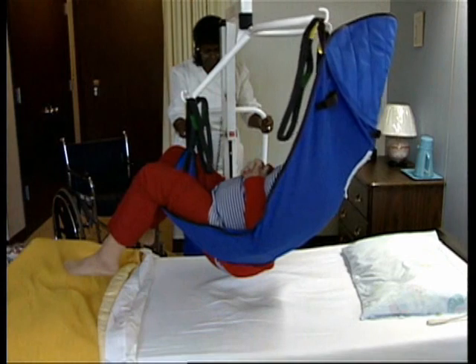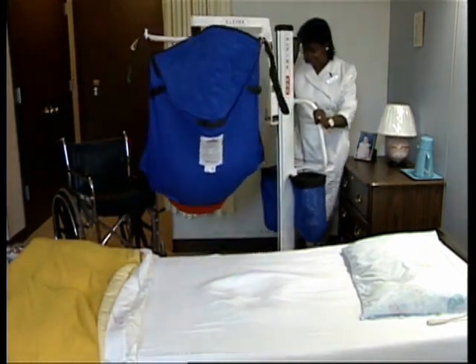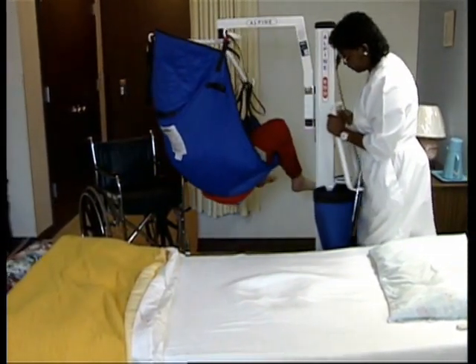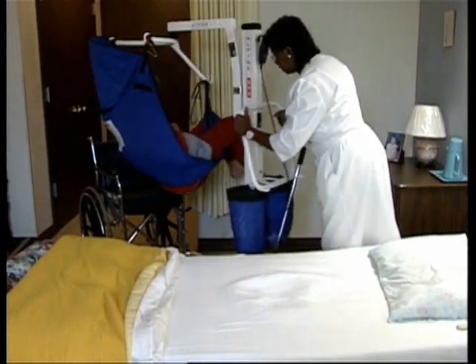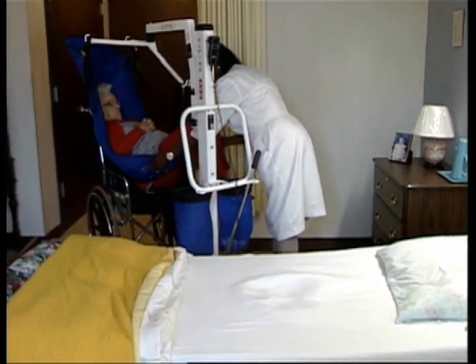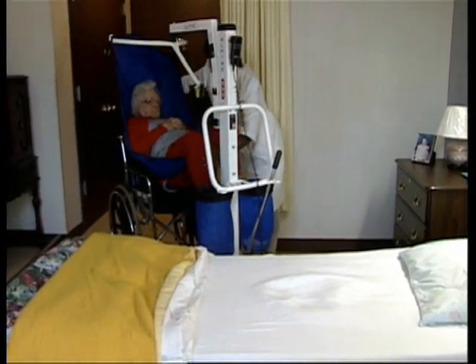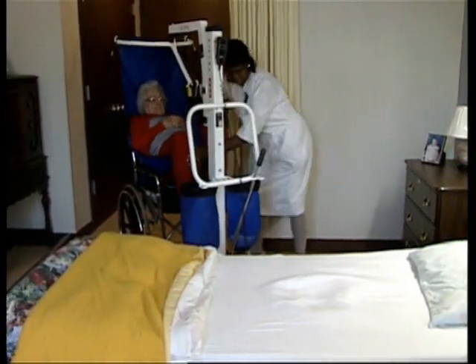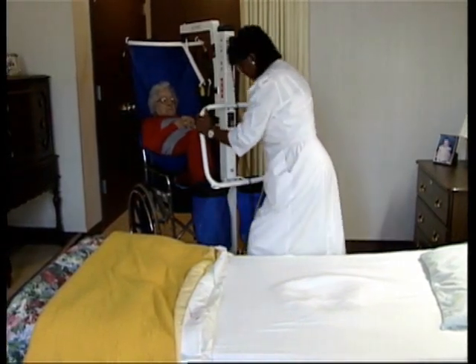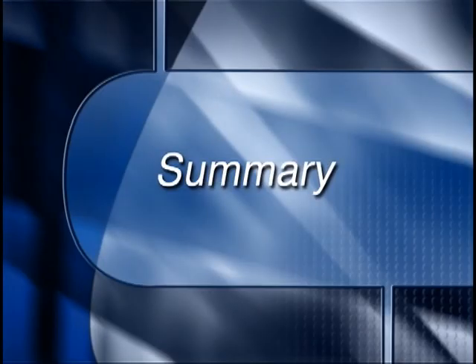The frame of the device is mounted on wheels so that you can transfer the resident to a desired location where they can be lowered and released. Some facilities recommend leaving any assistive pads or slings under the resident until the return transfer. The goal of this practice is to help assure a safe return and relieve strain on the caregiver who is providing assistance. Although a mechanical lift takes more time to perform, it makes transferring easier and safer for both resident and caregiver. Instruction on the proper usage of a particular device should be given by qualified personnel.